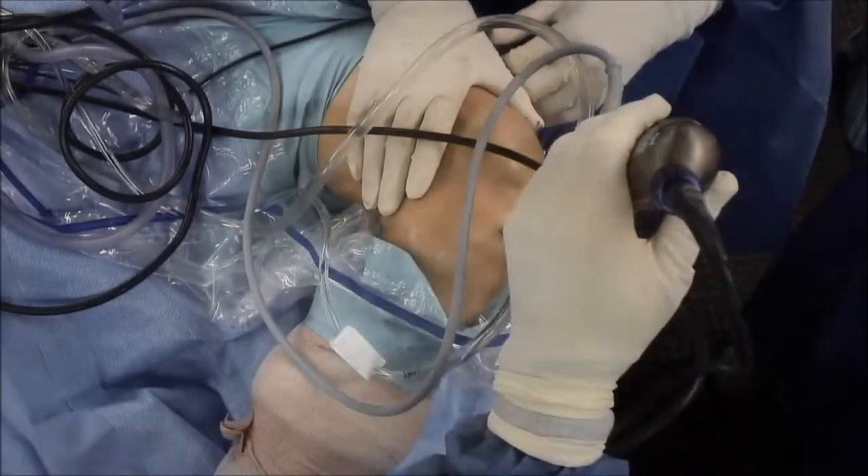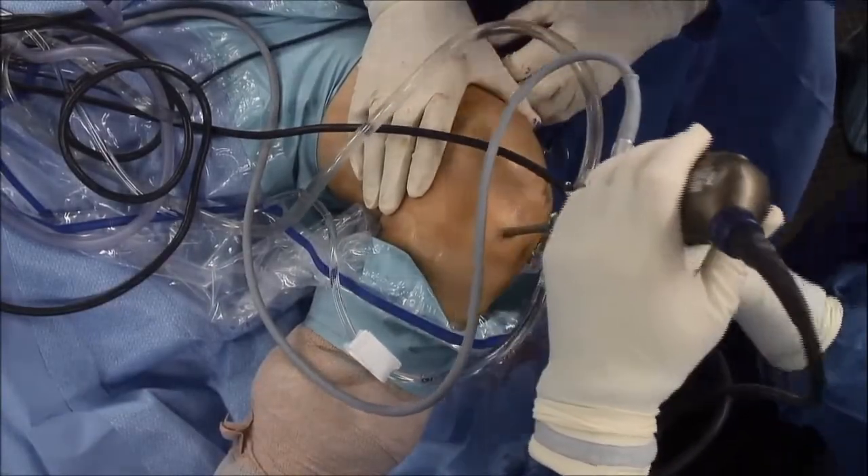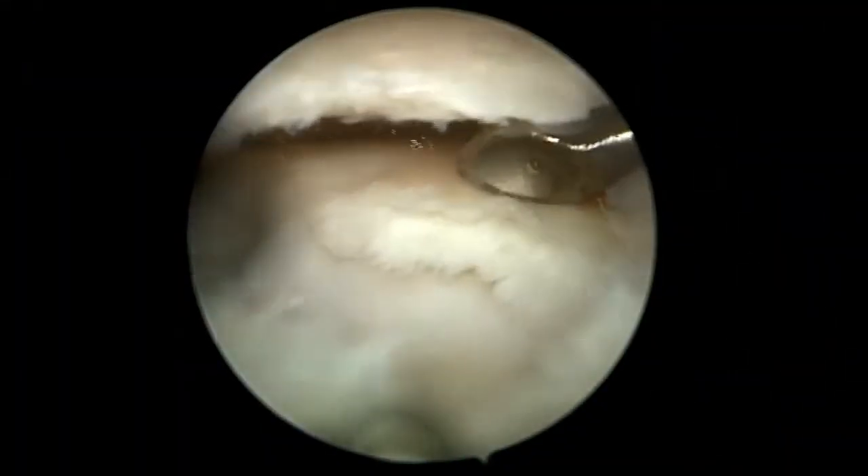The arthroscope is then switched to the inferomedial portal, and a curette is used to debride the loose delaminated articular cartilage.